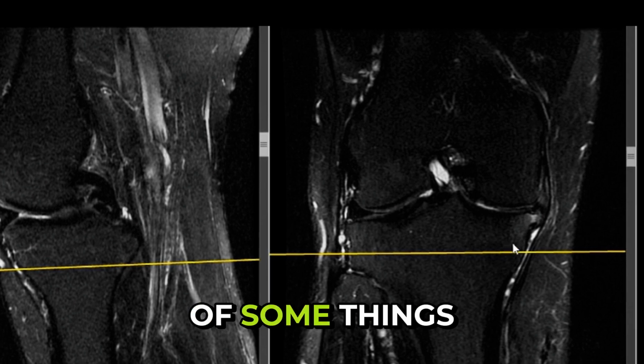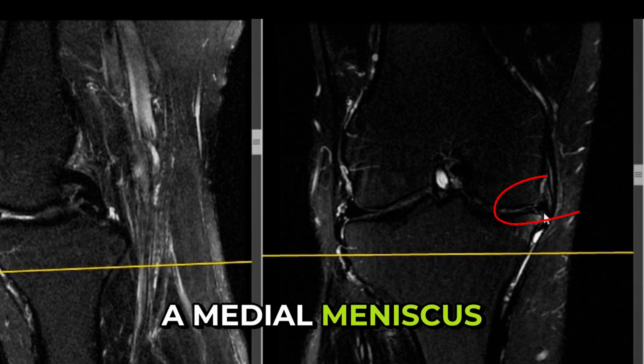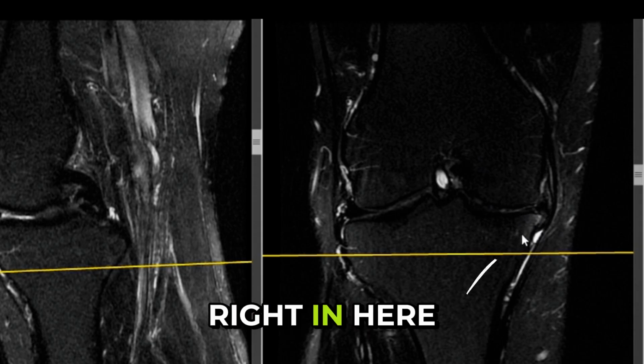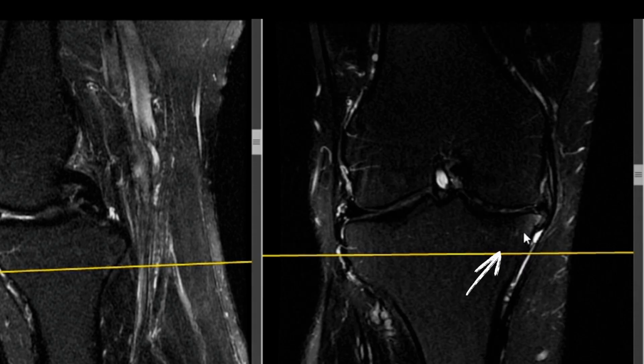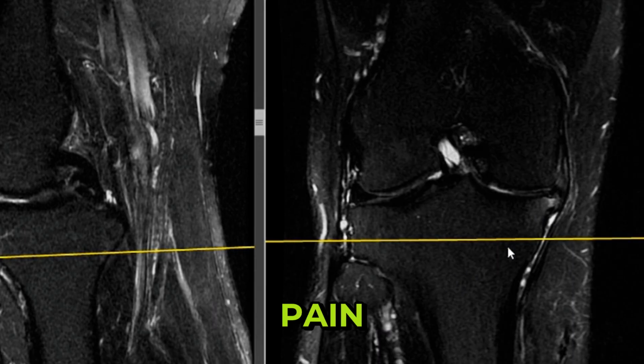We found some things that we would expect, and had seen on ultrasound: a medial meniscus complex tear. I was looking for bone marrow edema. He does have a small, tiny bit of bone marrow edema right in here at the medial tibial plateau, which correlates to where he has pain.